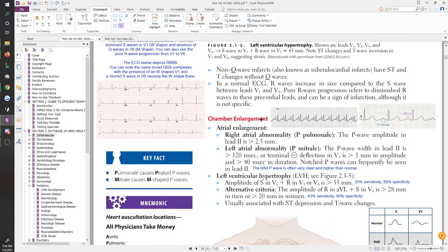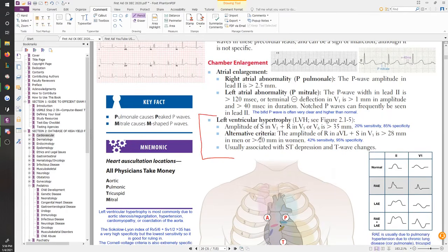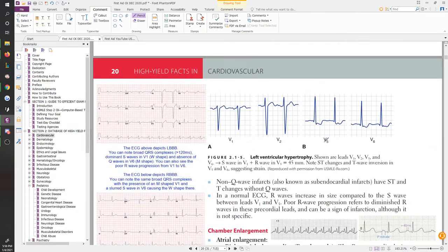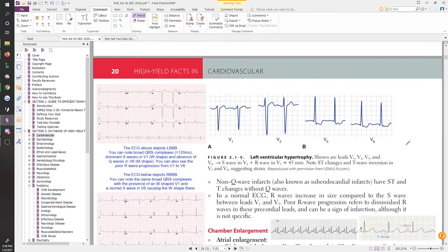So left ventricular hypertrophy, not so easy to catch, and thankfully not really something clinically used either, because if you look at what they teach you for left ventricular hypertrophy here, look at it. There's a couple things. You could either look at the S wave in V1 and add that to the R wave in V5 or V6, and it should be more than 35, which is what they're showing you here. That numerology is stupid. Just think of it like this. If V1 and V6, the first and last guy, are both really, really tall, your left ventricle must be really big. Right? That's left ventricular hypertrophy. That's all that really means.